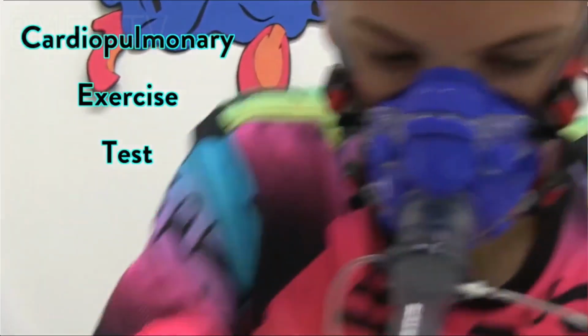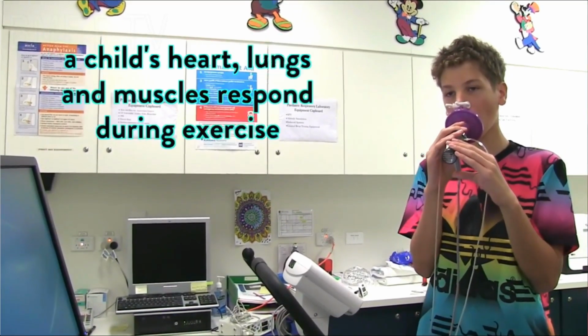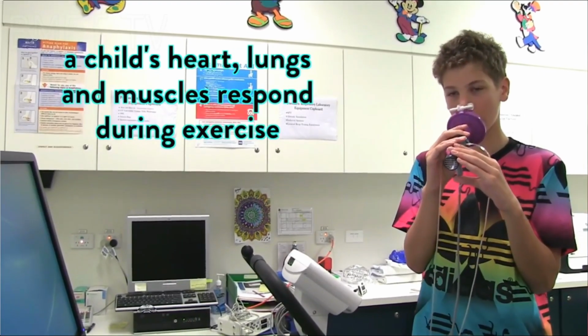Let's look into the types of ECG machines. First is the cardiopulmonary exercise test, or CPET. A cardiopulmonary exercise test is an evaluation of the cardiopulmonary system. This test is used to detect any cardiac or pulmonary diseases.